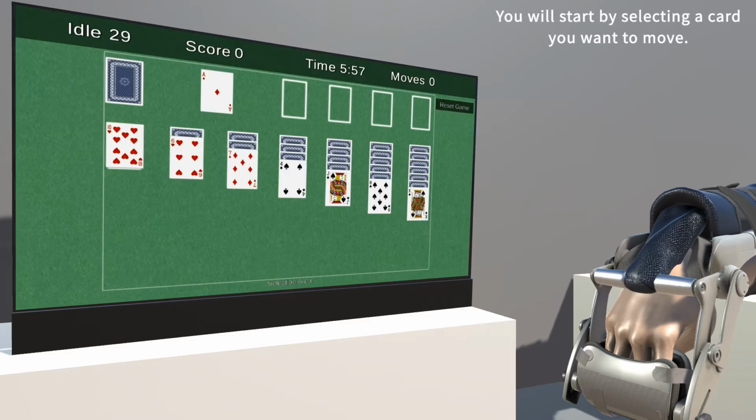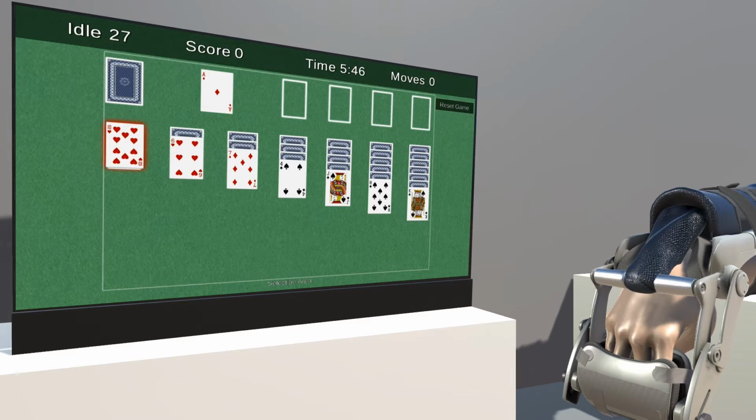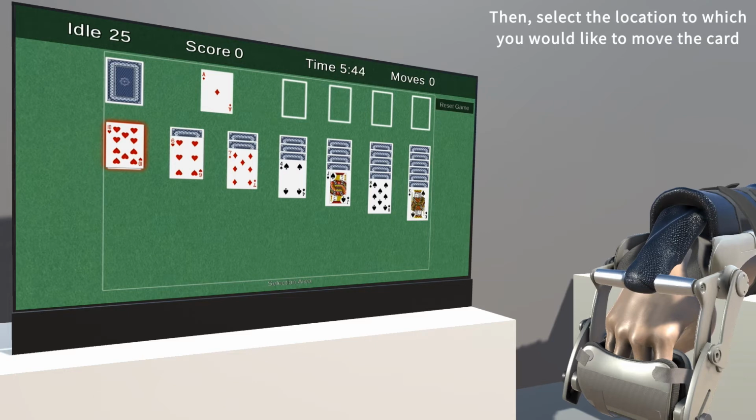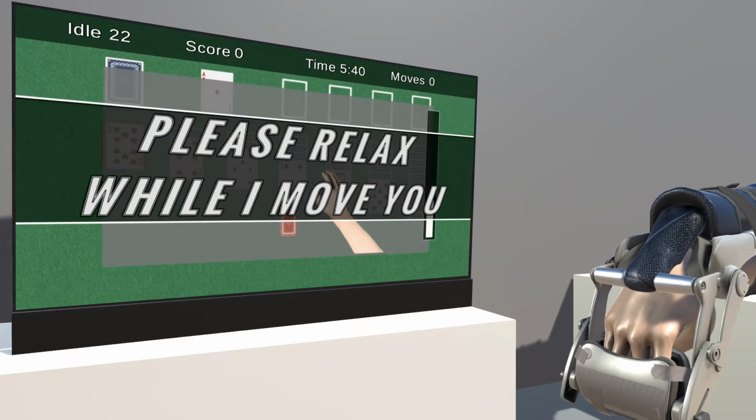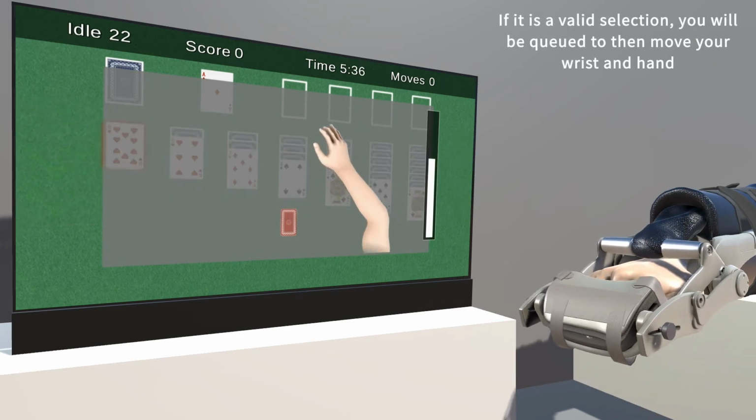You will start by selecting a card you want to move. With your hand that is not in the hand mentor, touch the card you wish to move. It will become highlighted after you touch it. Then select the location to which you would like to move the card. If this is a valid selection, you will be cued to then move your wrist and hand.